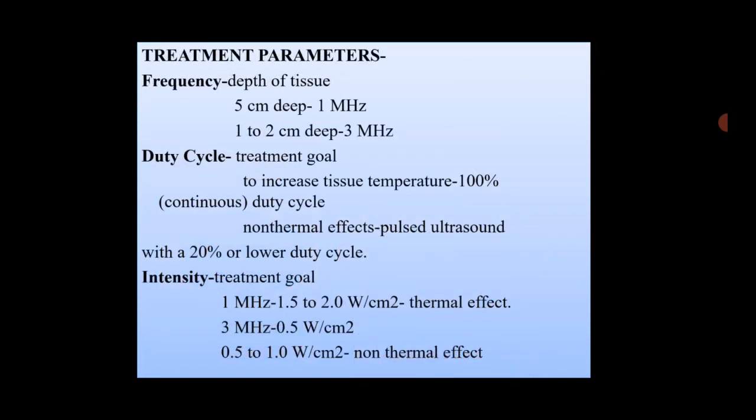Then coming to the treatment parameters. You have to select the frequency according to the depth of the tissue. If the depth of the tissue is 5 cm deep, then you have to select 1 MHz. If the depth of the tissue you want to treat is 1 to 2 cm deep, then you have to select 3 MHz.